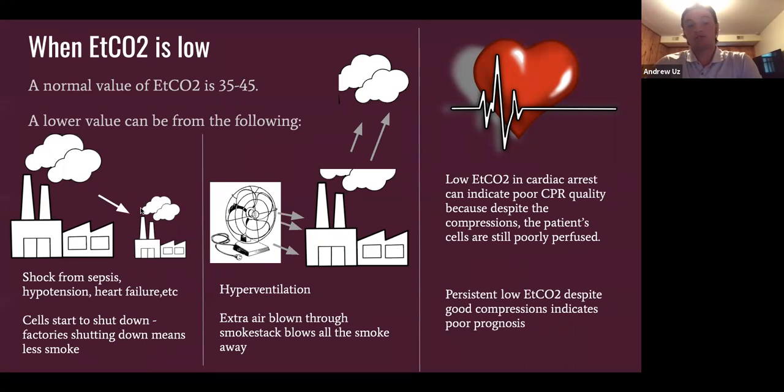And this is compounded by the next section here. In the middle, you can see there's a fan, and that's blowing away some of this smoke. So this measurement here, if you look coming right out of the smokestack, is lower. There's less smoke because the fan blew it all away. So this is from hyperventilation. So if you sit there and breathe rapidly, it'll cause that.